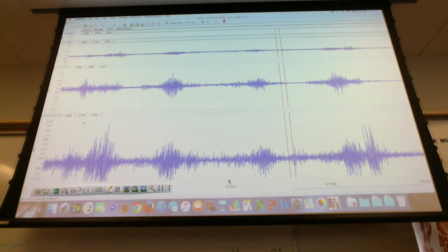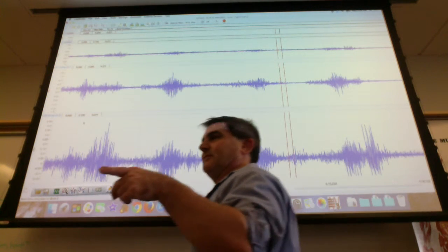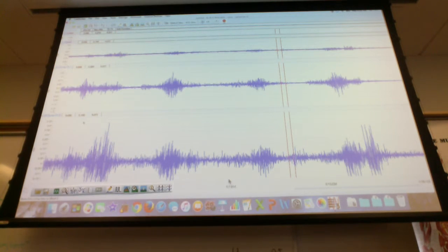7.65, okay? 1.119. Okay. What was your average value for biceps during flexion? Us? Yeah. 1.209. Okay, and you had, for biceps during flexion? For this group? 0.757, okay. Okay, so that makes sense that they're depolarizing, right? And we can measure something.